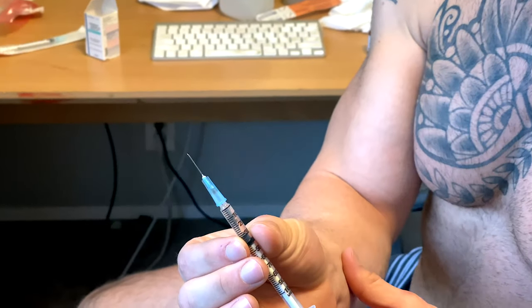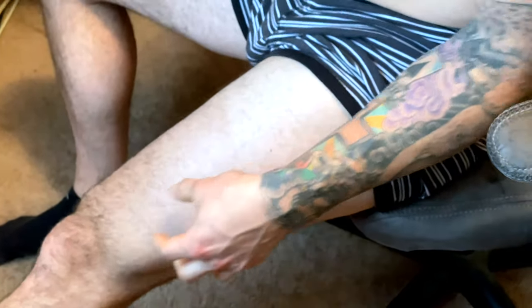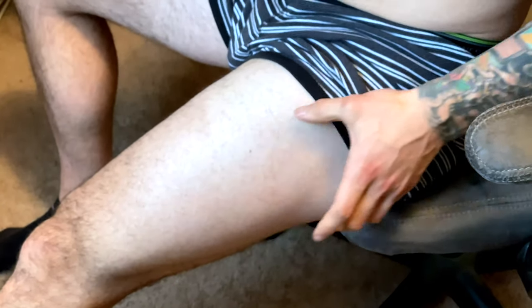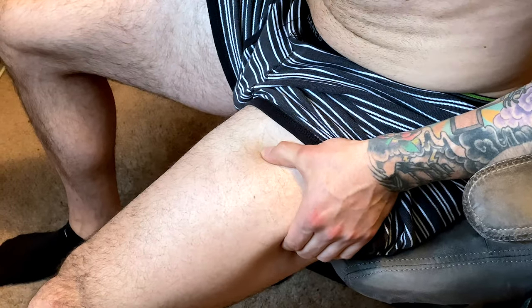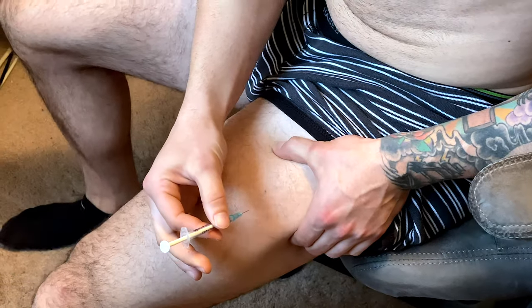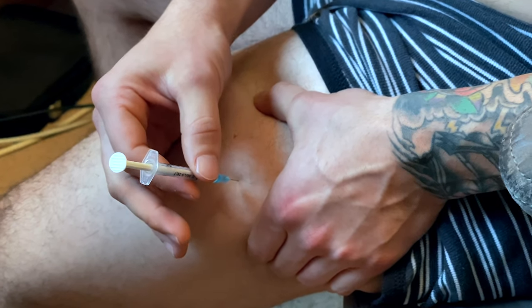Zoom in to make sure you can see that real well. Here is the outer quadrant of my thigh. I was doing down here for a long time, but I've made my way up and it's going a lot better. So I grab the meat of my leg, shake it off, try to relax my foot, take my needle — and I press in.